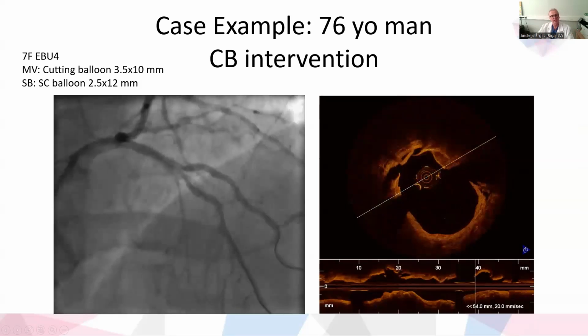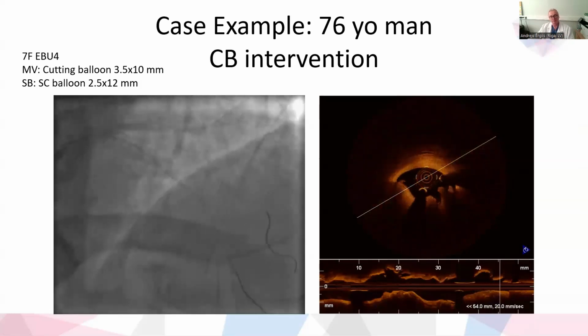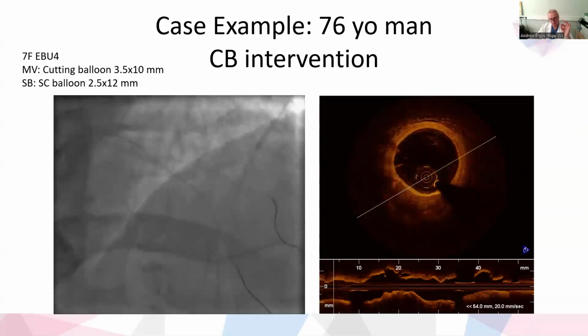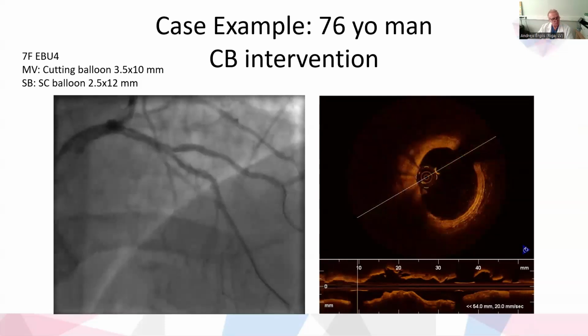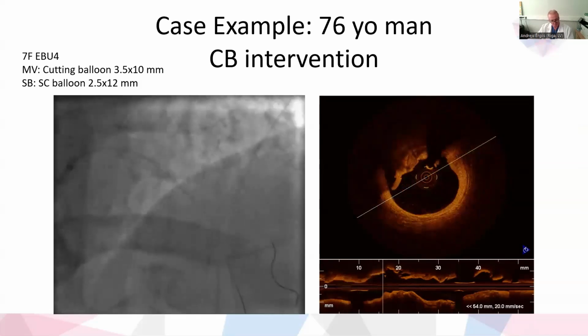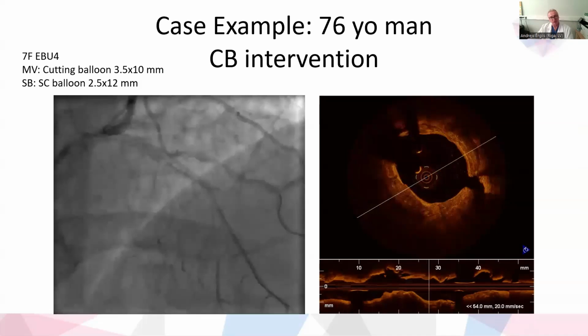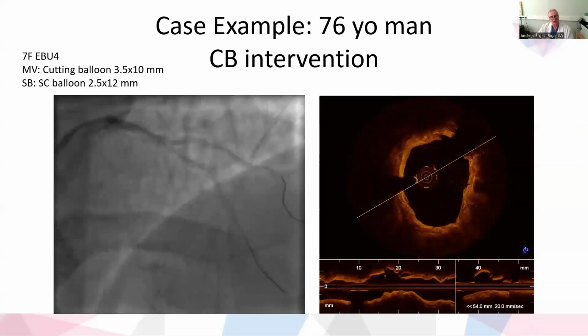Now we have IVL, which is an ultrasound device for plaque or calcium, which can be used to destroy calcium.